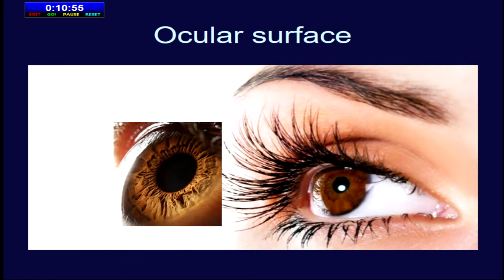Then if you see the meibomian glands, they are very much reduced. The numbers are very, very low. So that is very consistent with the diagnosis of Stevens-Johnson syndrome. You don't need this to diagnose it, but still I'm showing it. So in this patient, the dry eye has to be treated pretty well before you think of any surgery.